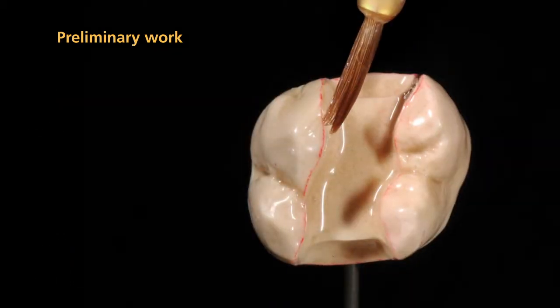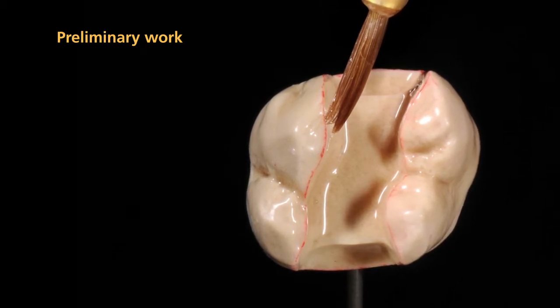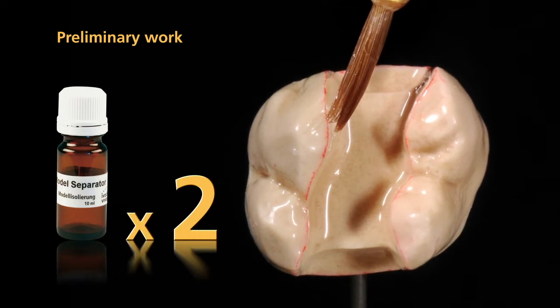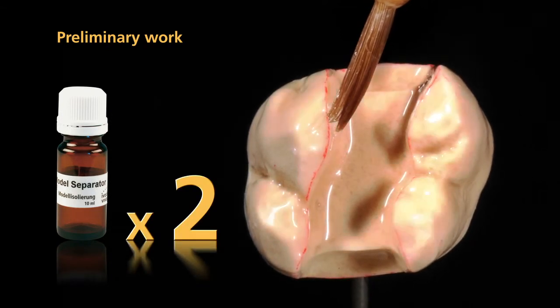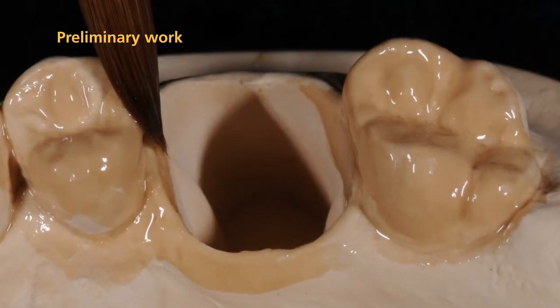Next, the dies and adjoining parts of the model are sealed. Apply SR model separator in two coatings. Make sure that all areas of the die are well covered. Please also isolate the adjoining model surfaces.